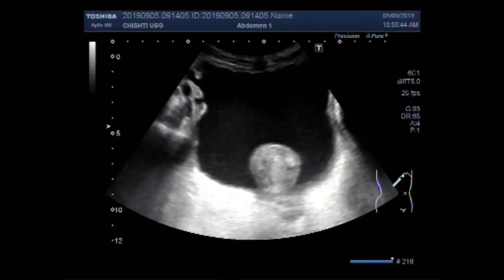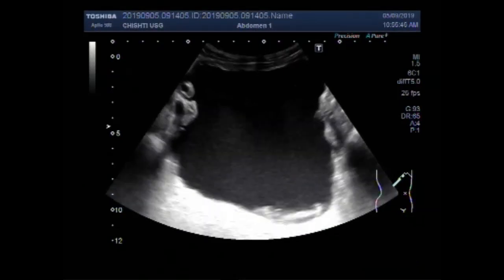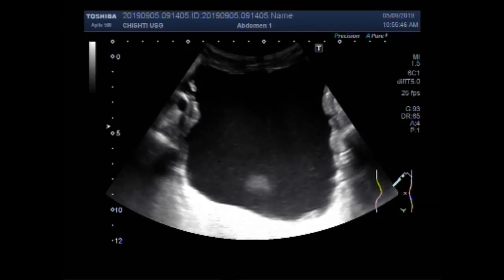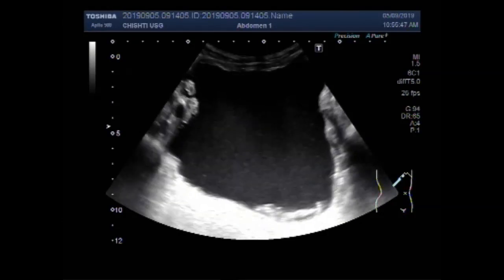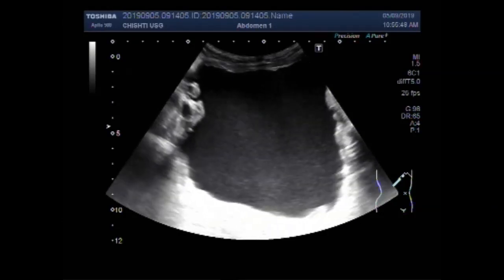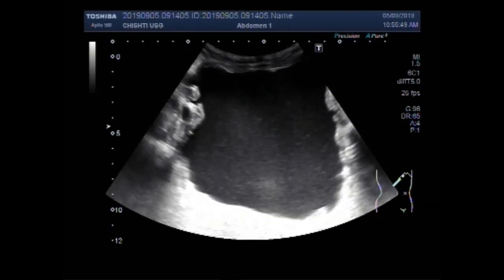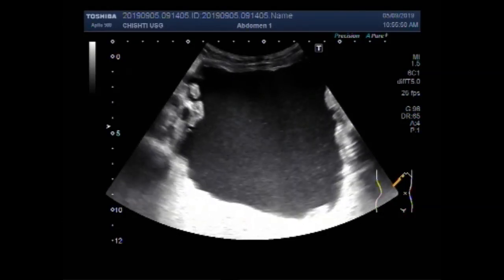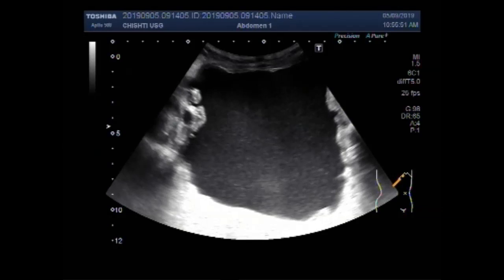Dear viewers, I hope you are all fine. This ultrasound video shows scanning of the urinary bladder.